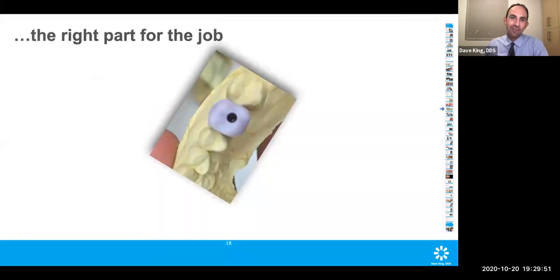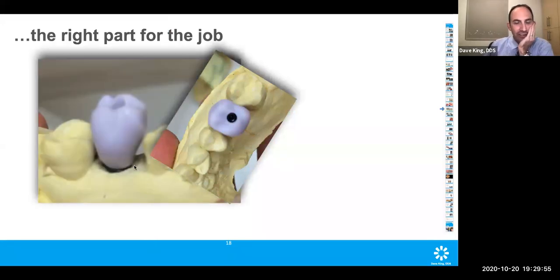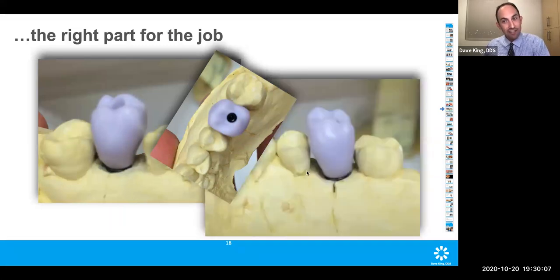All right. So here's that case. I'd forgotten I'd stuck that video in there. So this is what happens when you tell the computer you're using a scan post, but you use a tie base. You get a crown that's like 8 millimeters too tall. And I didn't realize that until I put it on the model and thought to myself, I don't think that's going to adjust into the bite. So make sure when you order pieces, that you order the right pieces, especially if you have an intraoral in-office scanner and manufacturing system in place.